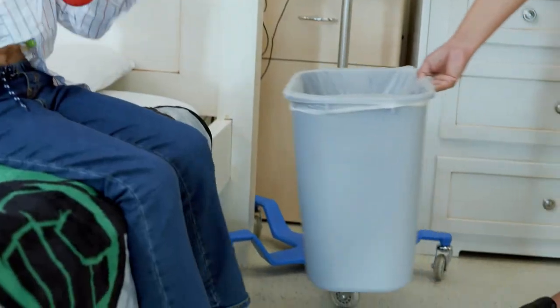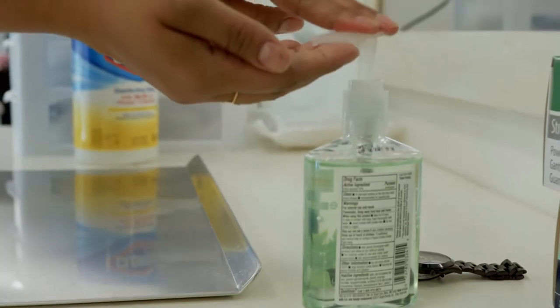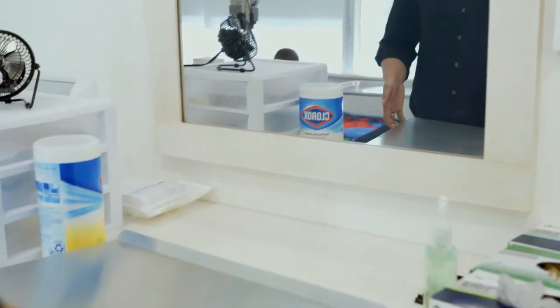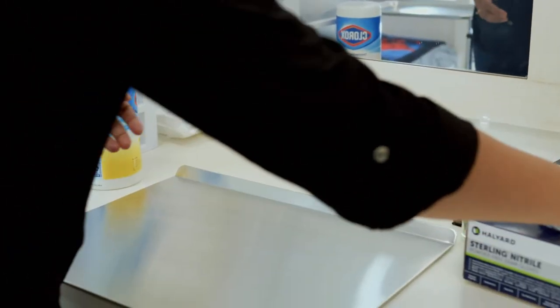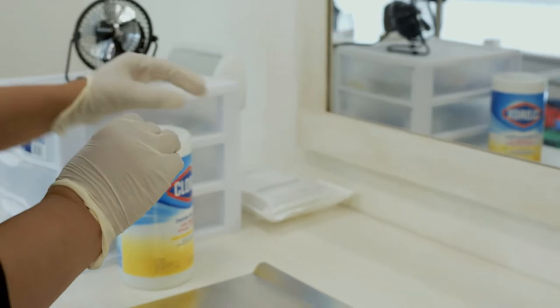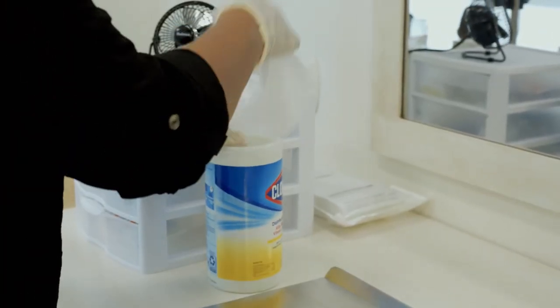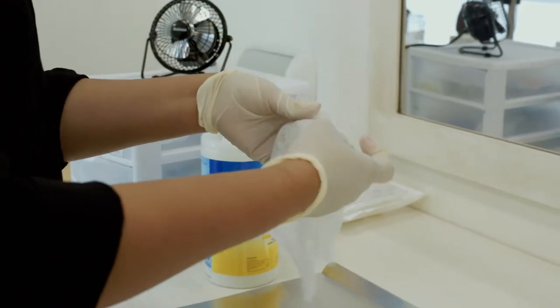Place a trash bin and hand sanitizer within reach. Find a hard non-wooden surface like a clean unused cookie sheet or metal or plastic tray. Remove any clutter from the hard surface. Clean the hard surface with a liquid disinfectant or wipes.